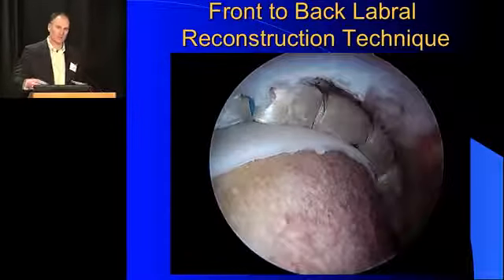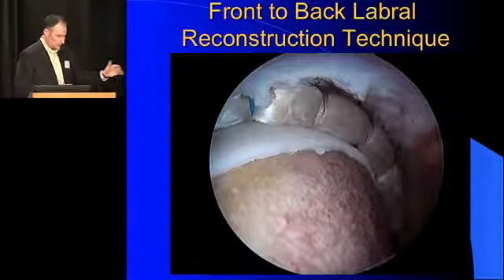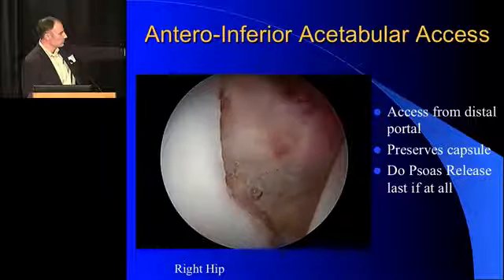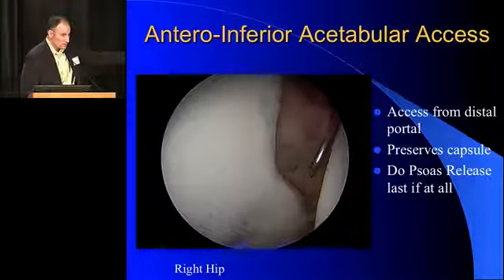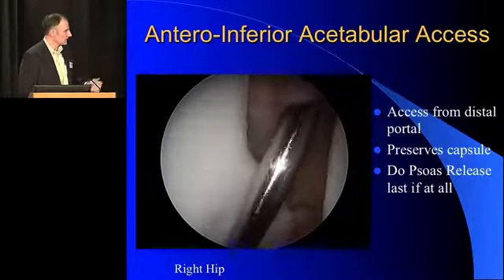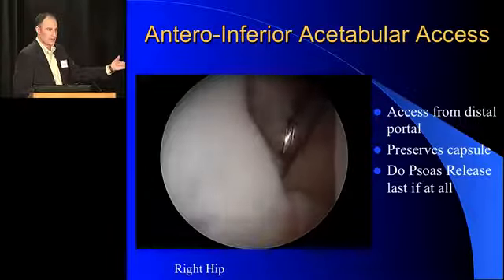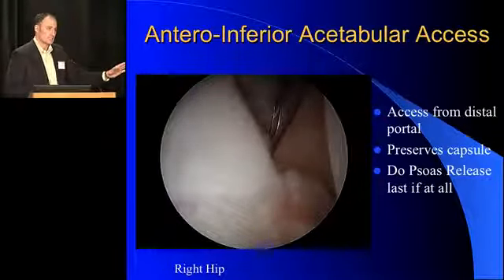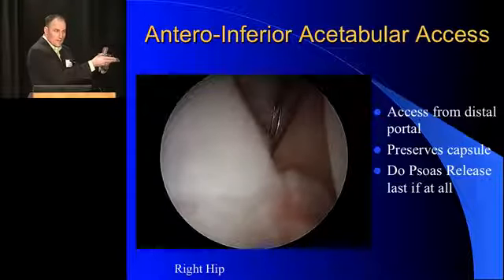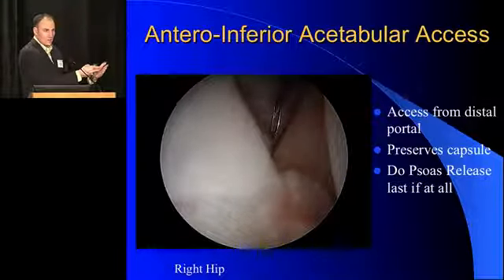This is a fast video and it oversimplifies the case. I'm frequently asked how do I get low. You preserve the capsule — you can see the needle coming from the distal portal, coming through the bottom part of the capsule. I use that then to dilate it up with a switch stick, then use the obturator for the cannula. Then I put my drill guide and you can see we get all the way down to the bottom of the joint — it's actually pretty easy. But the key is you have to have the capsule intact and the psoas intact, because you're coming from the skin around the femoral head into the joint, and without capsule or psoas there, you've got no hope of holding that position.